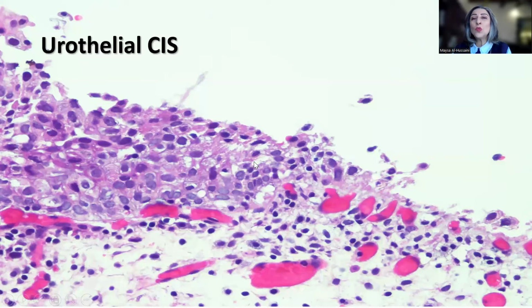One important way in order to confirm that this is of urothelial origin is actually to look at other fragments, trying to see if there is an evidence of carcinoma in situ, and this was the case for our patient. So this is one of the fragments showing a disorganized growth of the surface urothelium with hyperchromasia, with disordered growth with loss of polarity.